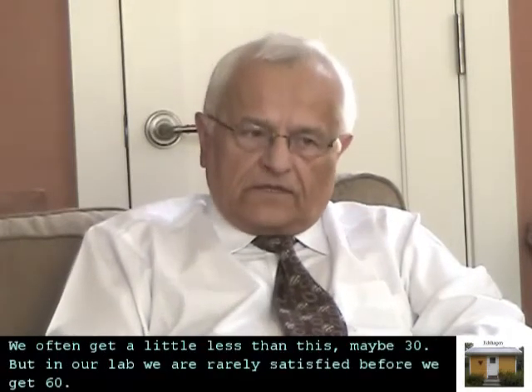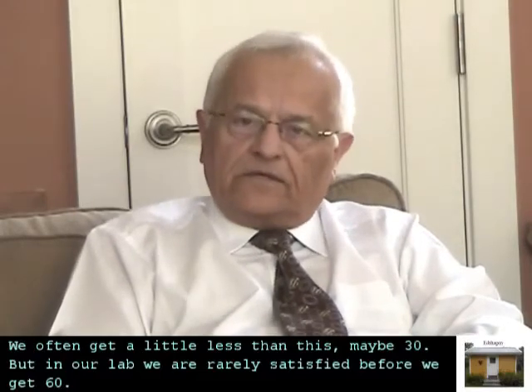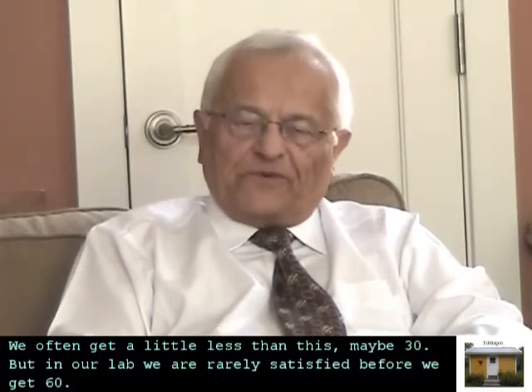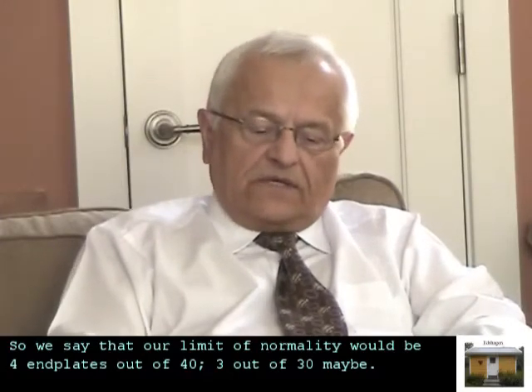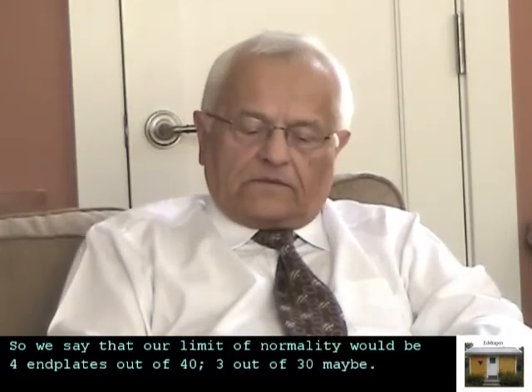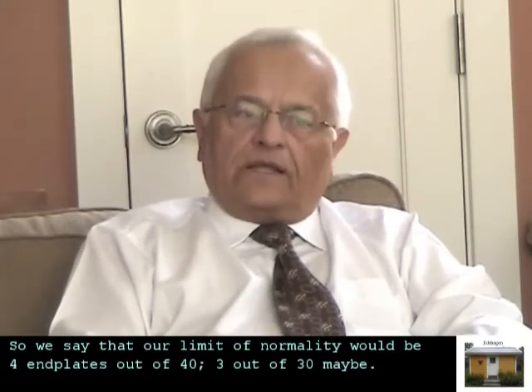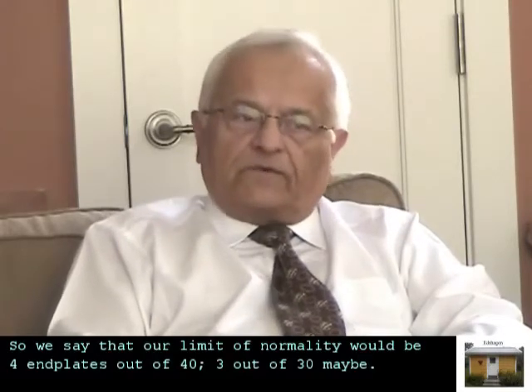We often get a little less than this, maybe 30, but in our lab we are rarely satisfied before we get 60. So we say that our limit of normality would be 4 end plates out of 40. 3 out of 30 maybe.